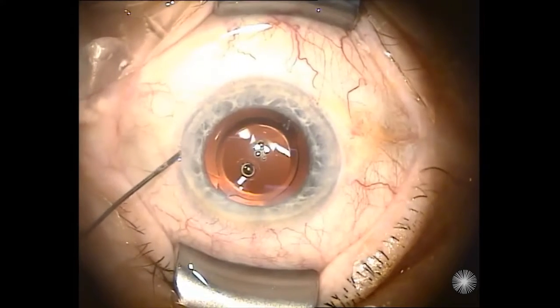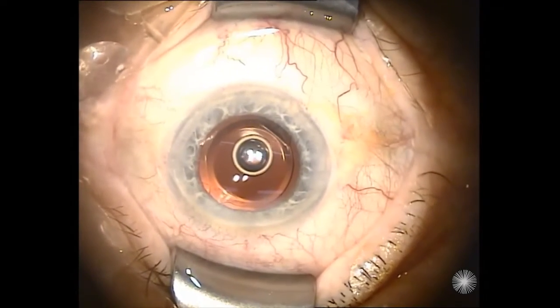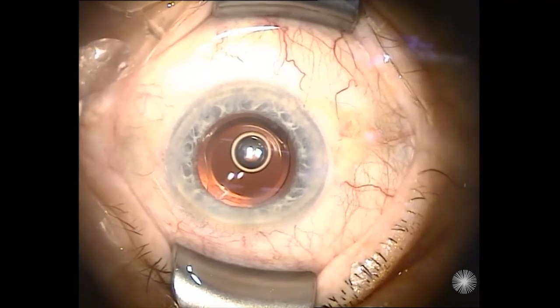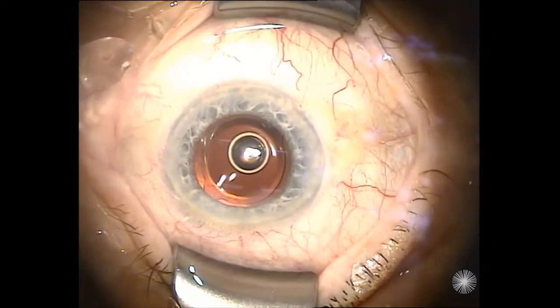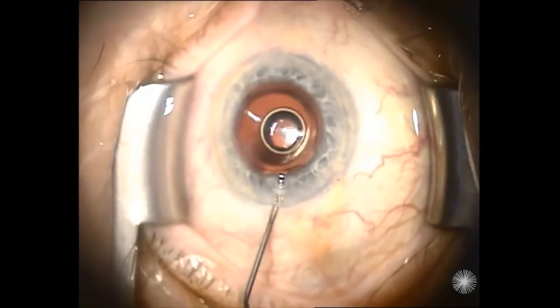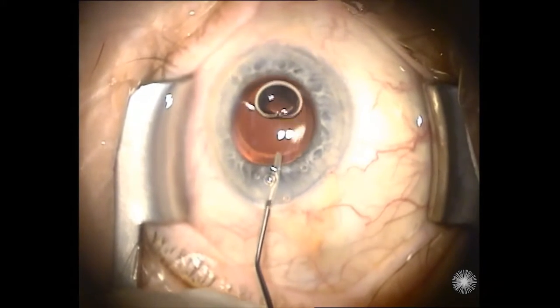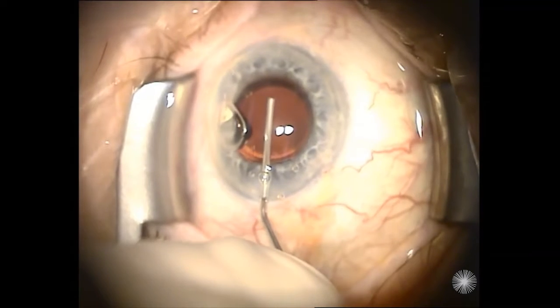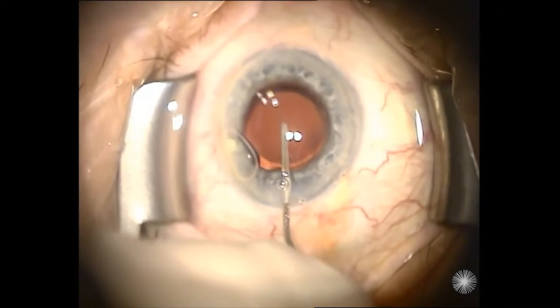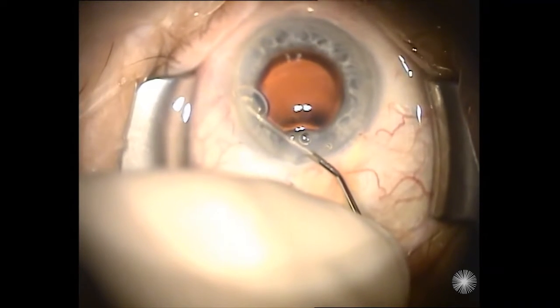We put right now miochol in the anterior chamber to get miosis of the pupil so we can do the iStent implant. So we move the microscope 90 degrees. We put more viscoelastic through the side port. There's an air bubble in the anterior chamber. So we have to absorb this air bubble to get a clear view of the trabeculum.